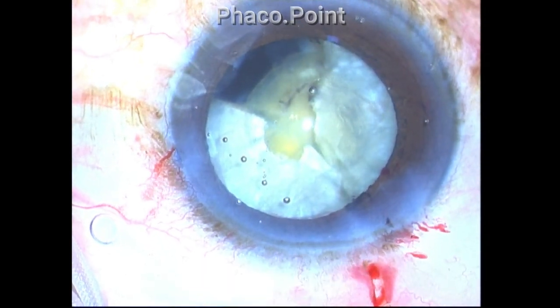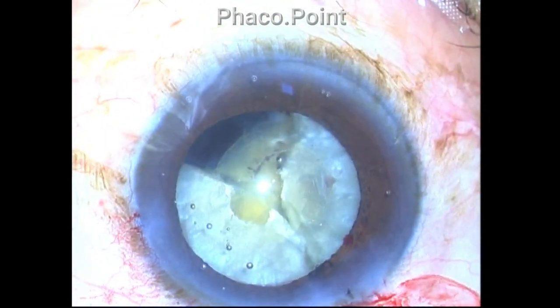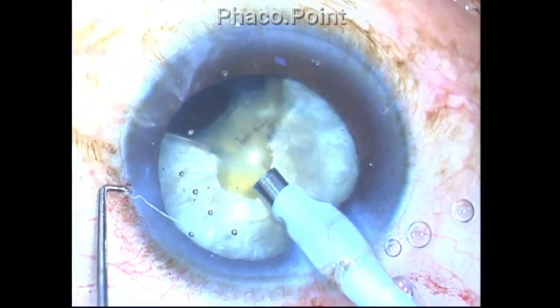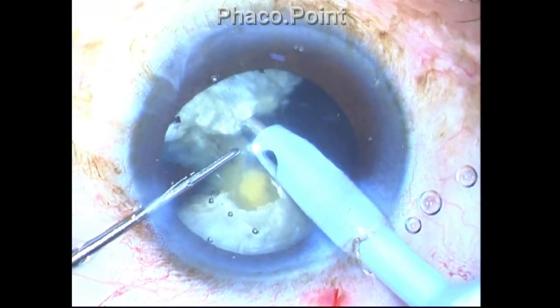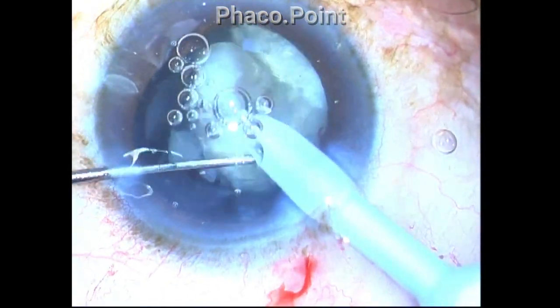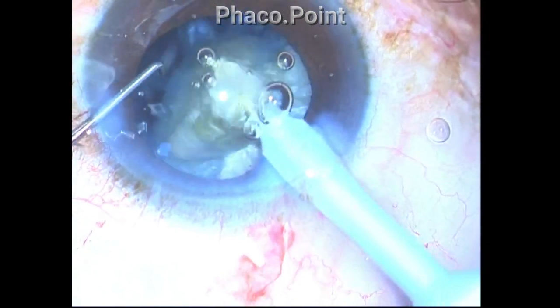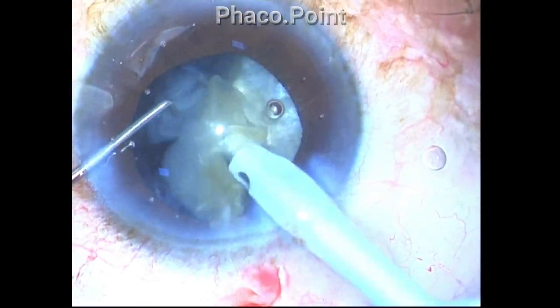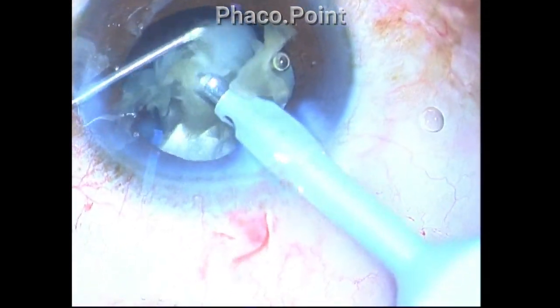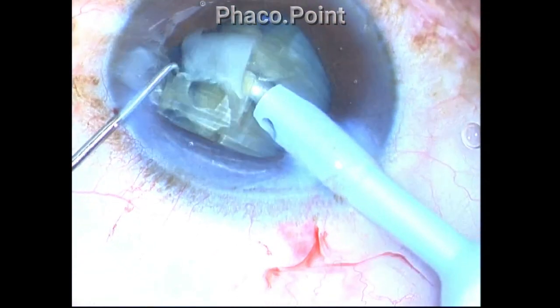After performing all this, I thought I could go ahead with phacoemulsification and now the chamber would be stable because I seem to have covered almost all possible aspects of why a surge could occur. So I went in more confidently this time, hoping against hope that the chamber will be stable now. But unfortunately, as soon as I started, I noticed that the chamber stability was not greatly improved even with all these interventions, and the chamber was tending to collapse. You can see how the pupil is narrowing down and how the chamber is fluctuating, and it is of course very dangerous to continue phacoemulsification in such a scenario. So I was totally at my wit's end as to what could be the possible cause.